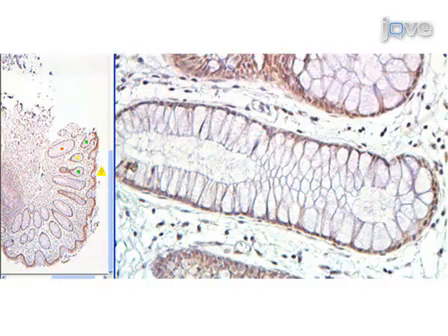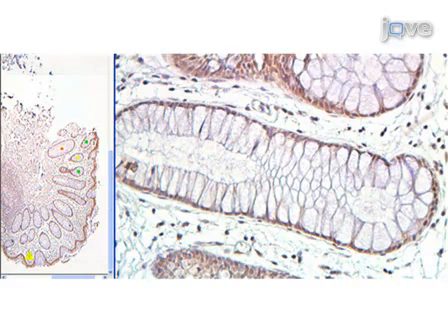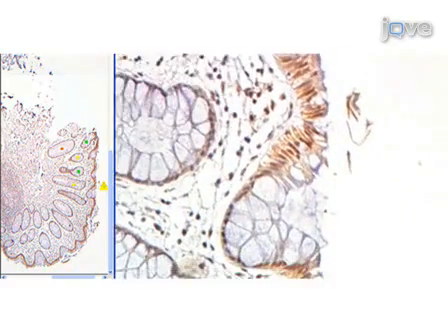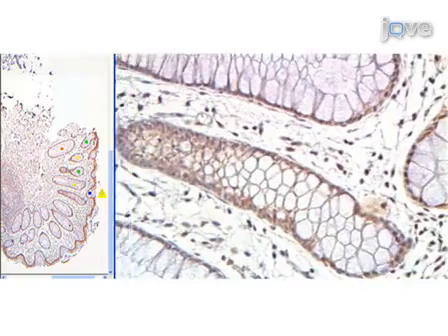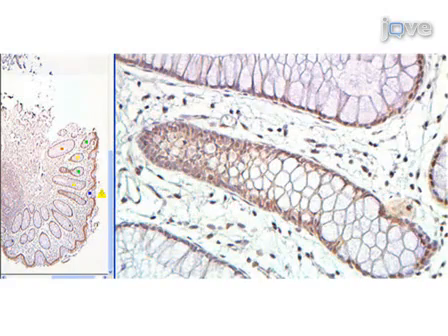This crypt has reduced expression of ERCC1 and is marked level 2 with a yellow dot. This crypt has high level 4 expression and we give it a blue dot. Overall, this crypt appears to have reduced expression level 2, getting a yellow dot.